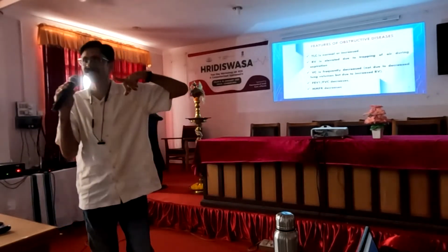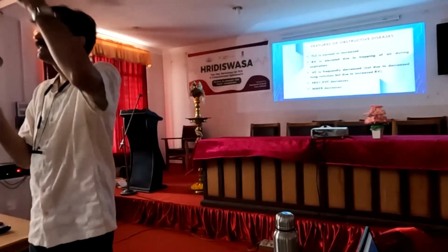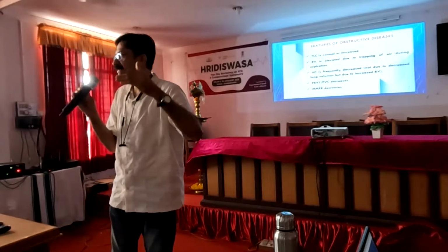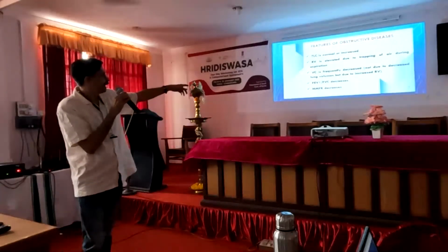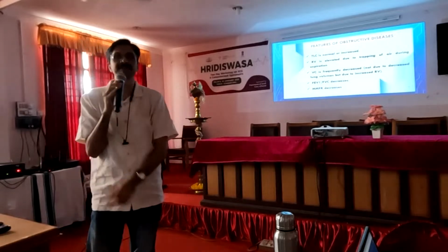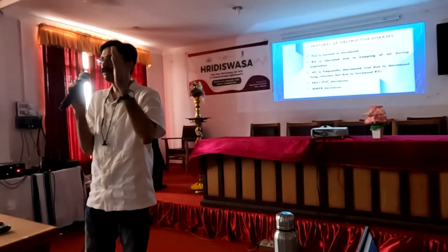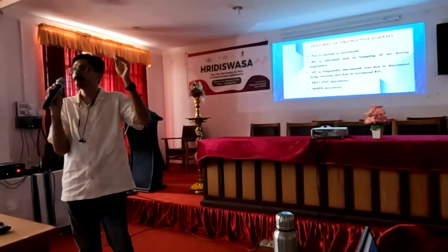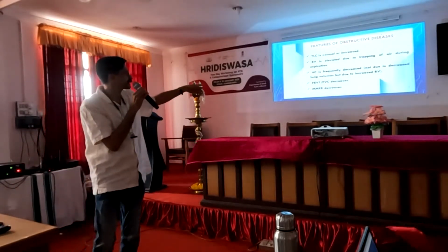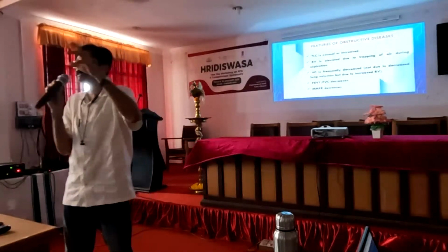Vital capacity is the maximum volume of air breathed out after deep inspiration. It is decreased because of the obstruction. FEV1 divided by FVC, the FEV1 percentage, decreases. We saw that in obstructive cases the FEV1 percentage decreases, and the maximum mid-expiratory flow rate also decreases. That is, the flow will always decrease.